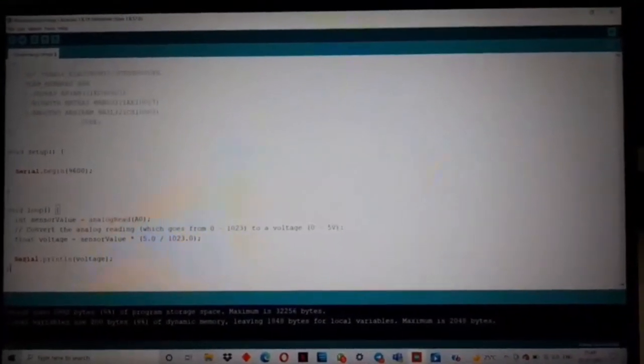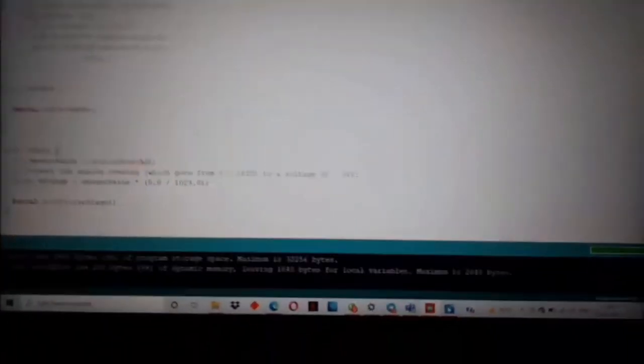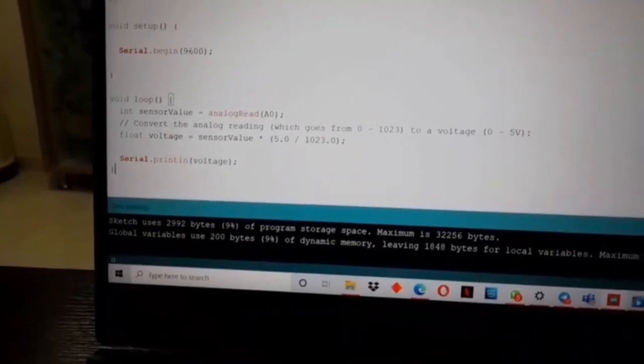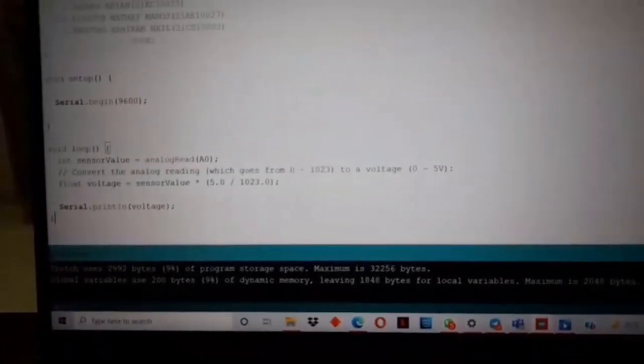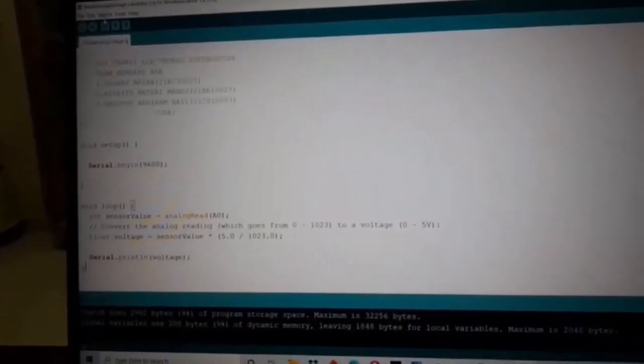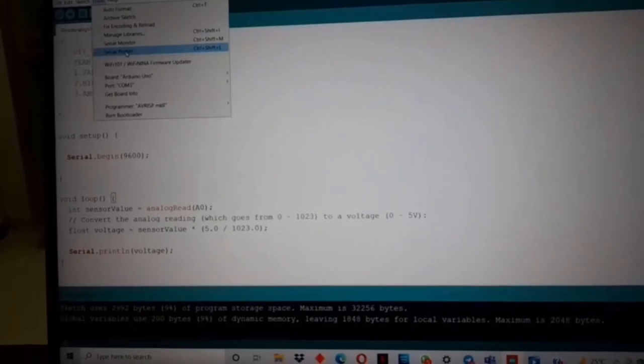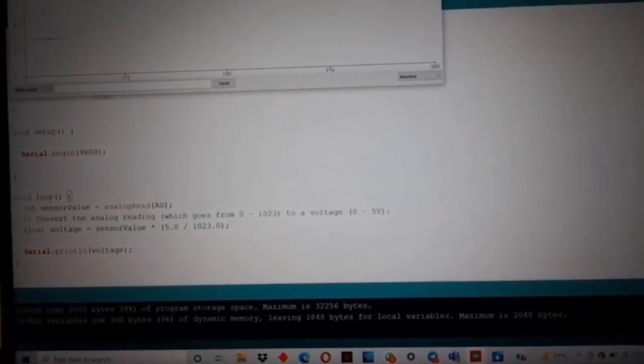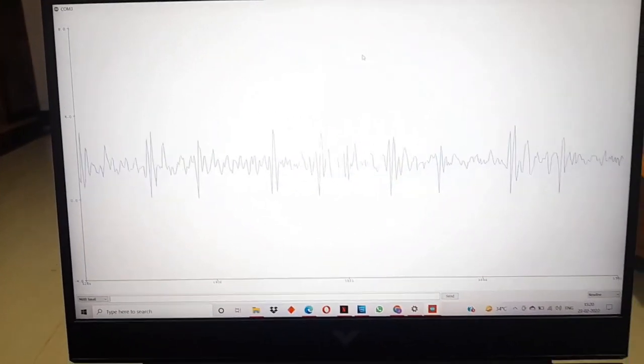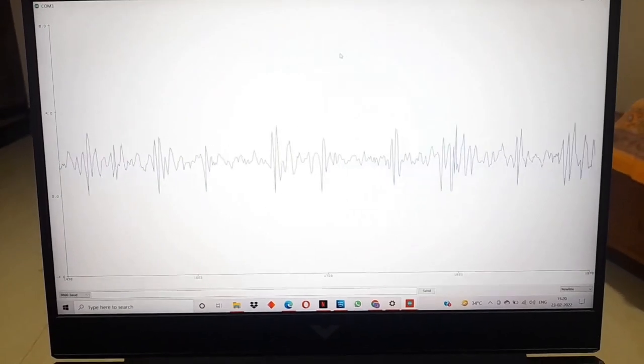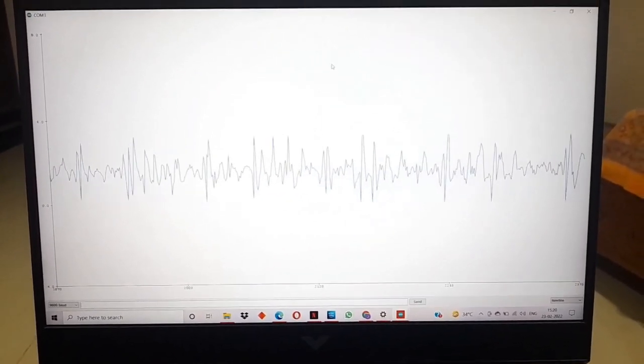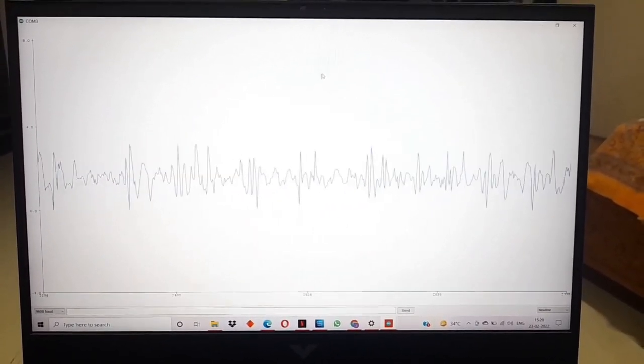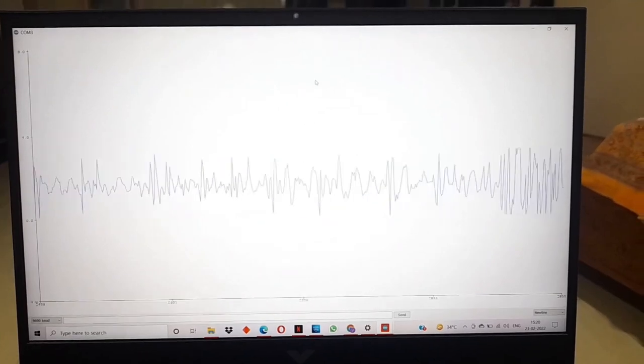Now let's compile the code by uploading it. It shows uploading, and then done uploading. When I open the serial plotter graph, it shows the reading of voltage versus time. Thank you everyone.